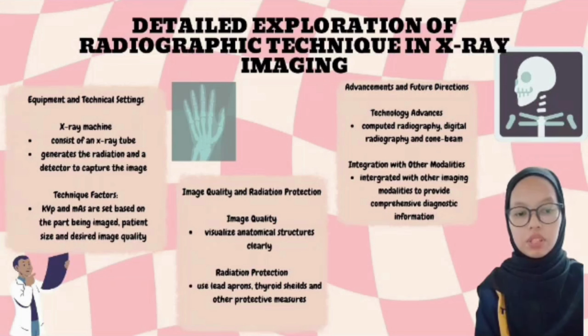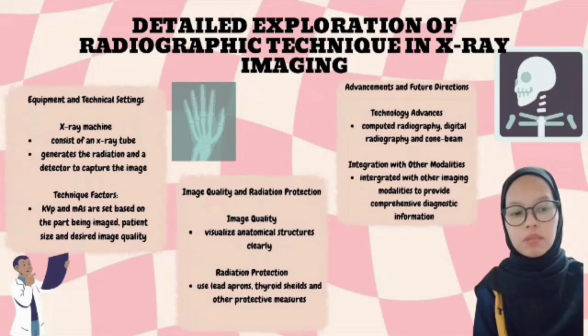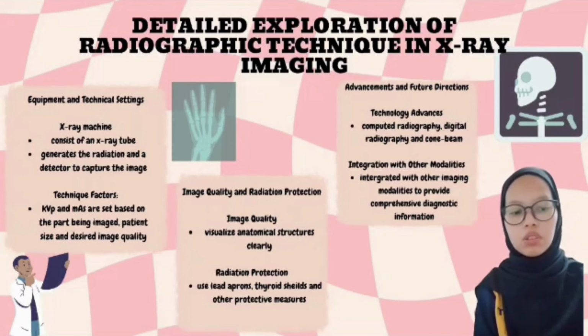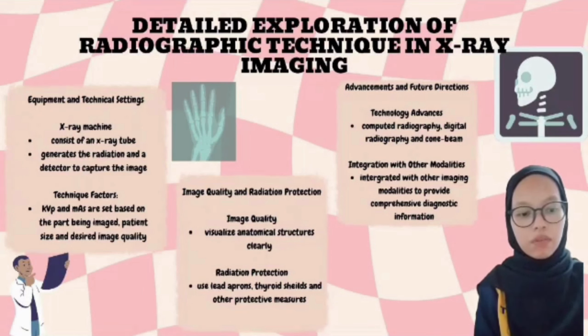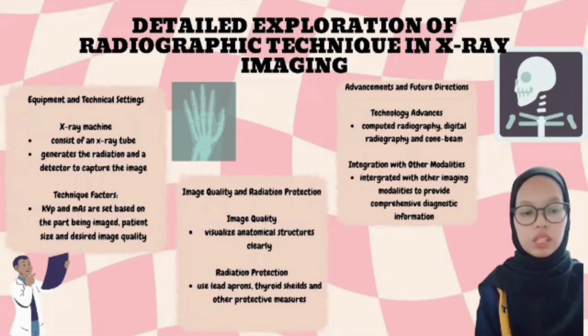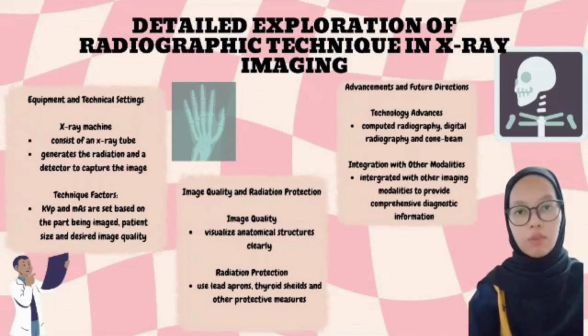And the last one is the advancement and future directions. For technology advances, developments like computed radiography, digital radiography, and cone beam CT continue to improve imaging capabilities and patient outcomes. For integration with other modalities, X-ray imaging is often integrated with other imaging modalities, for example, MRI and CT scan, to provide comprehensive diagnostic information.